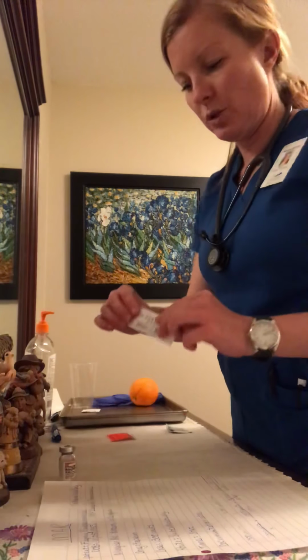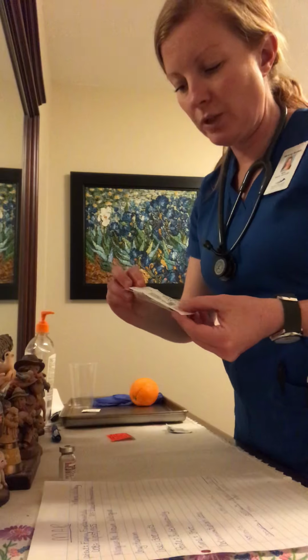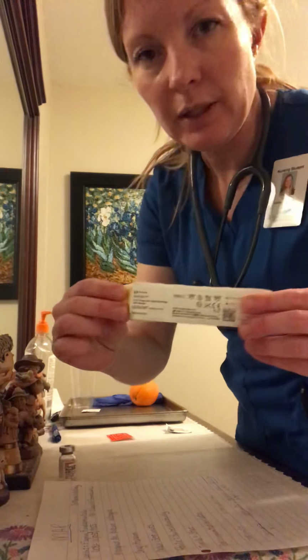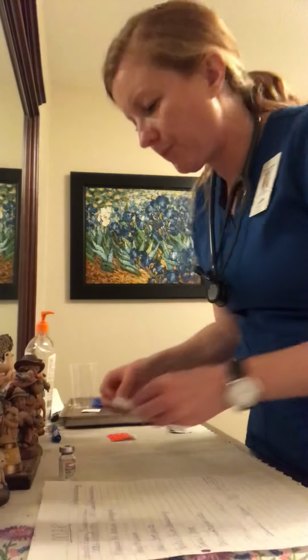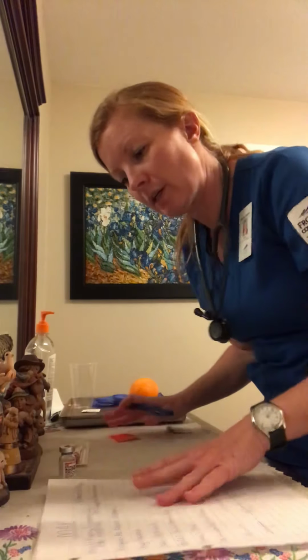Next, I'm going to choose the proper syringe. I have a 1 milliliter tuberculin safety syringe. That's what we're going to be using today. And then next we are going to be filling out our medication label.